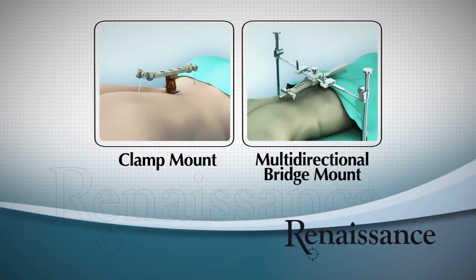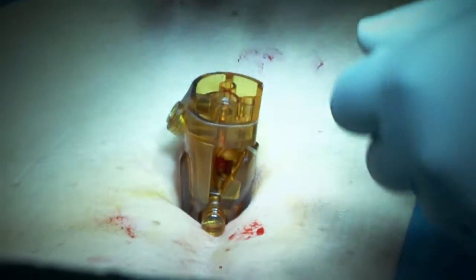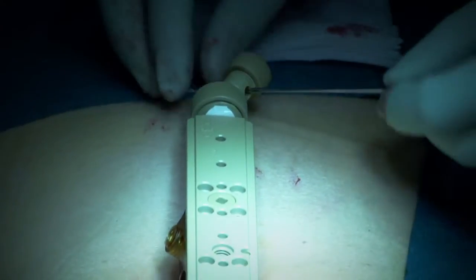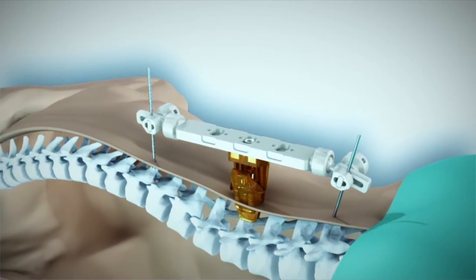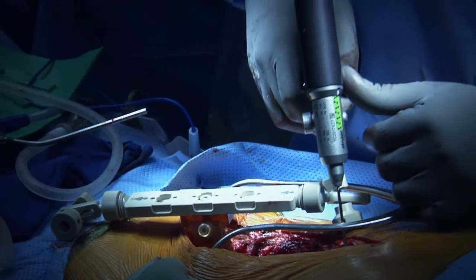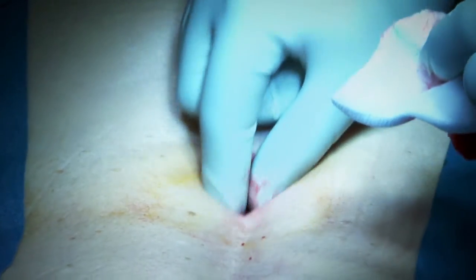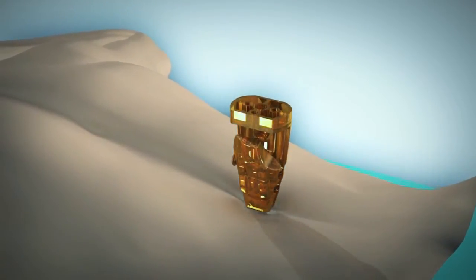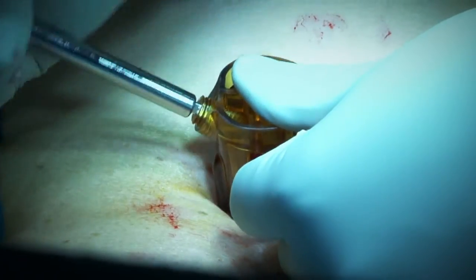The most commonly used platforms are the clamp mount and multi-directional bridge mount. The clamp mount is attached to a spinous process. A bridge is then mounted onto it with two K wires above and below, locking the spinal segment and maximizing stability. While the clamp mount is most commonly used for scoliosis and deformity procedures, it is also suitable for minimally invasive surgeries. A 3 cm incision is made to insert the clamp mount, which can later be used for decompressing and inserting an interbody.